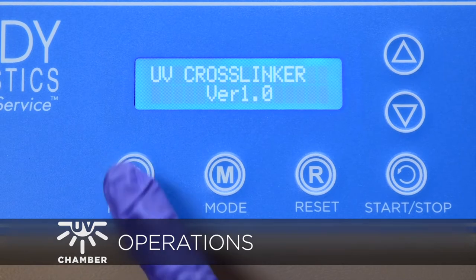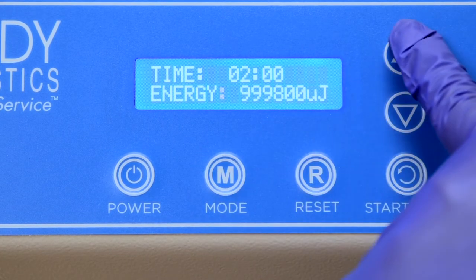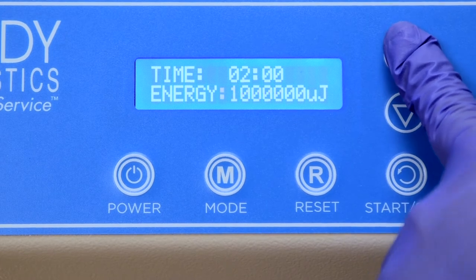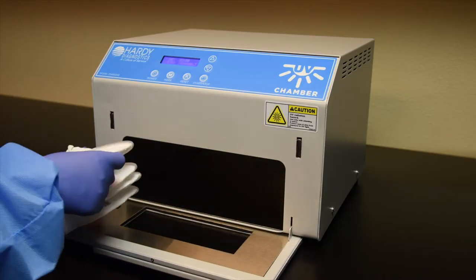First, power on the unit. Select Energy Mode, then set to 1 million microjoules. Open the unit and place 4 N95 masks face up.